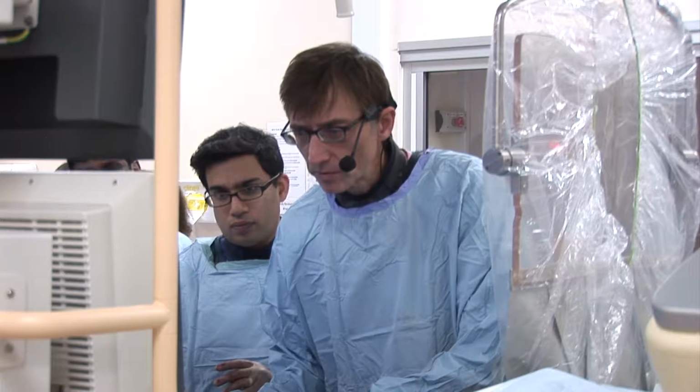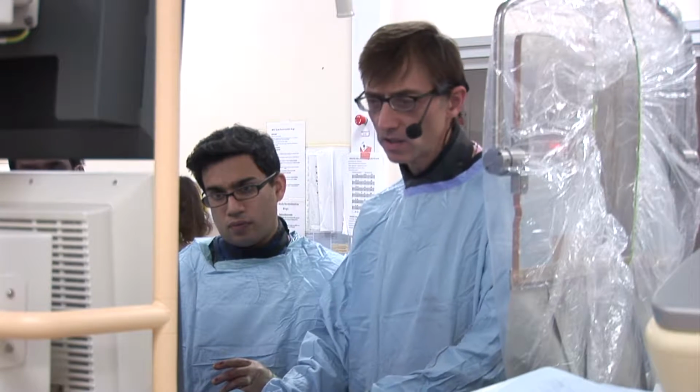The only way to treat a blockage like this is to pass a fine wire through and out to the other side, so that it sits in the vessel beyond the blockage. On this wire, it's then possible to pass equipment to enlarge the fine tract created by the wire until it's large enough to be treated by inserting a stent to scaffold the artery wide open and so restore normal flow and relieve the patient of angina symptoms.